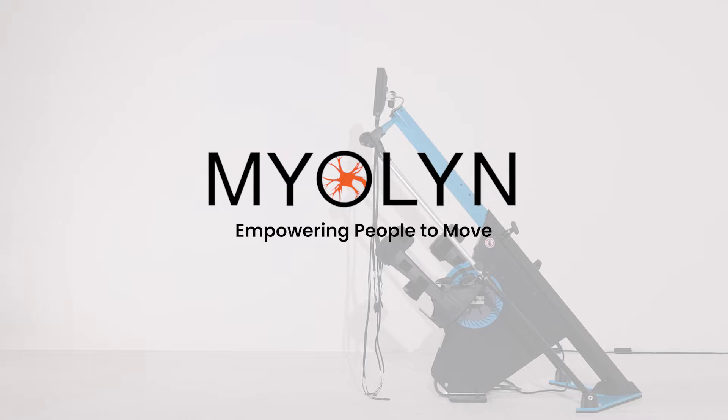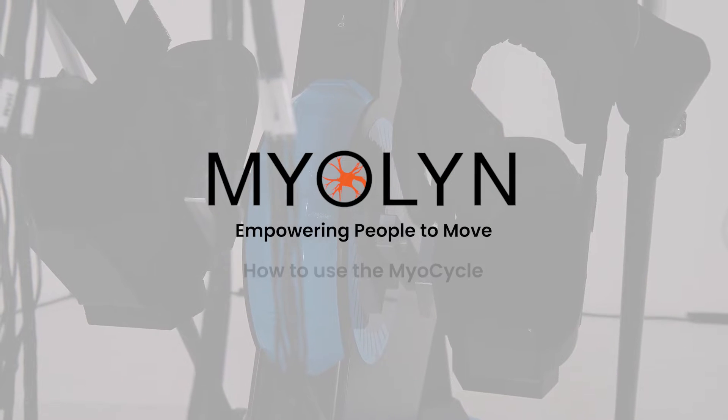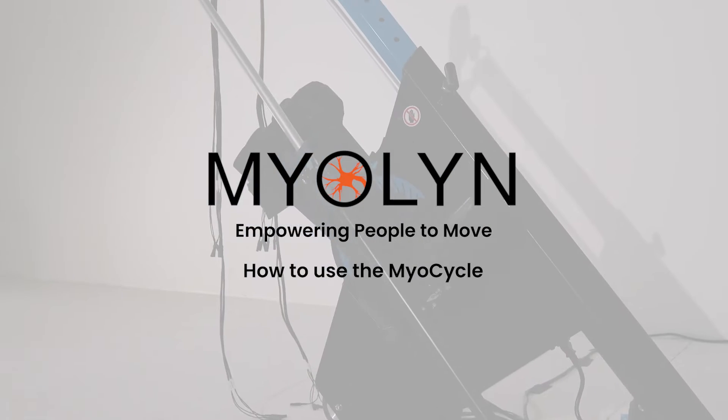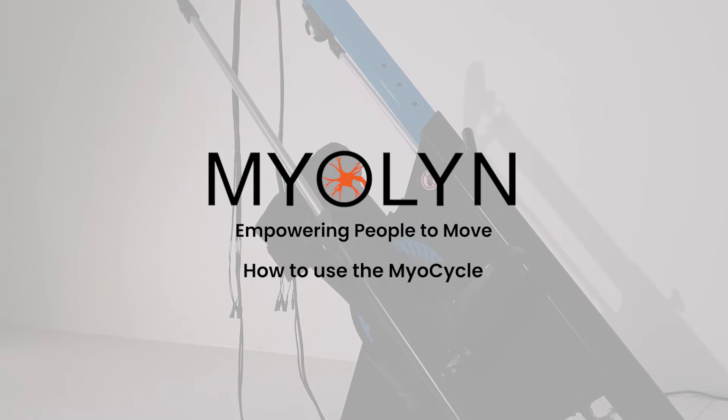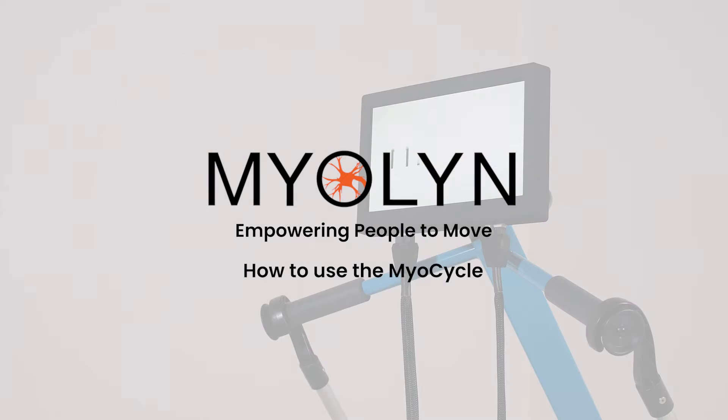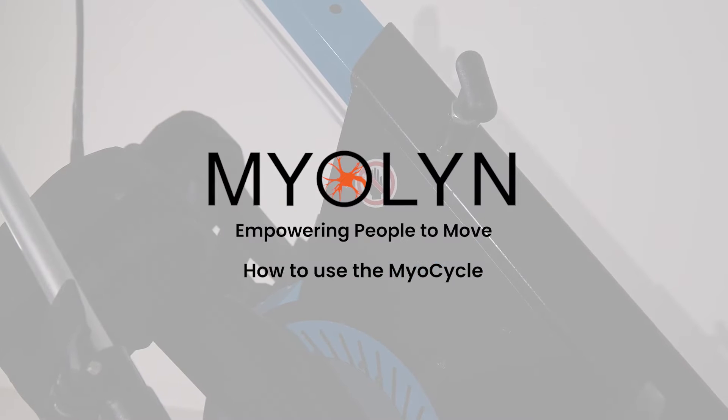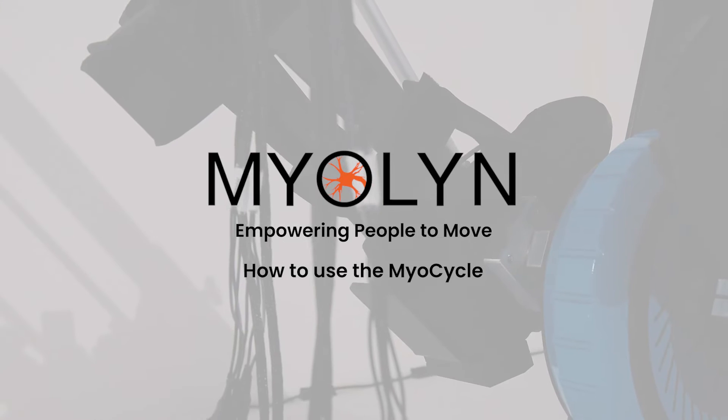Congratulations on your new myocycle! Your road to improving your quality of life begins with getting set up and starting your first session. This video is your overview guide to getting started. This video is not meant to be your only resource. For more detailed information, please refer to your myocycle user guide.